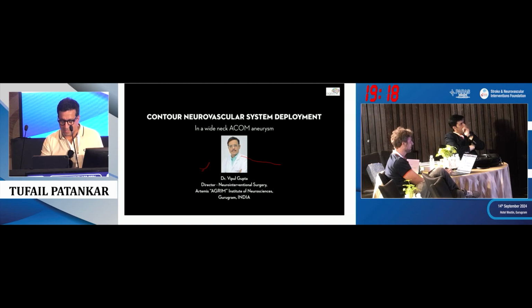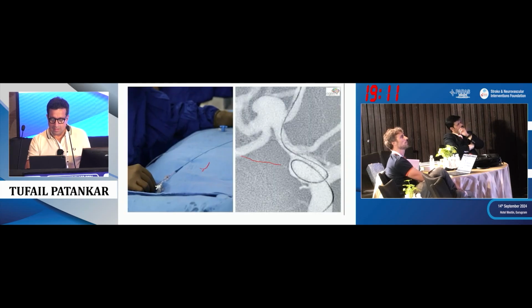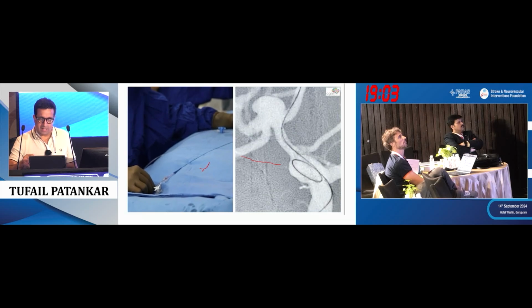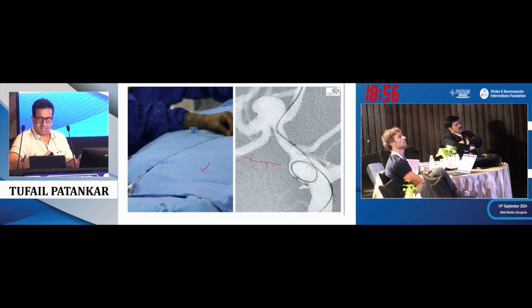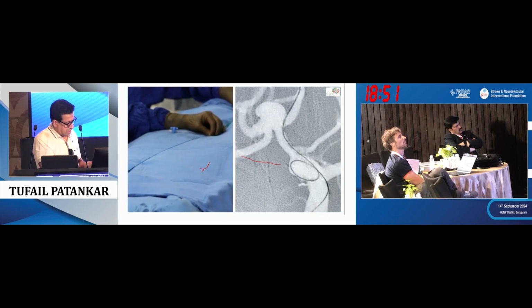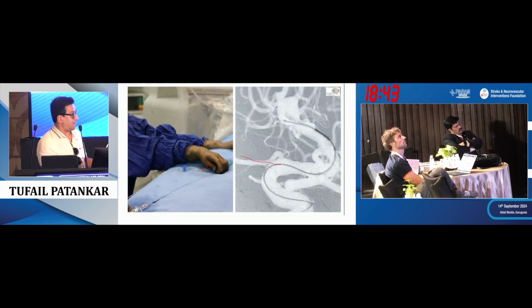What is important is to try to get into that artery there, and hopefully the video works well. So basically, like any coiling procedure, you get your best view. Here you can see what Vipul is trying to do. He's trying to access the aneurysm. You see the neck of the aneurysm. You can see that he's trying to get around. Here you can see the manipulation. In the workshop, I was trying to get everybody to understand.